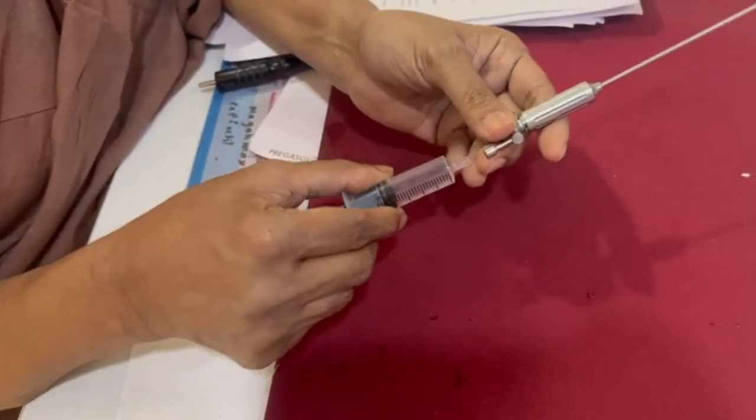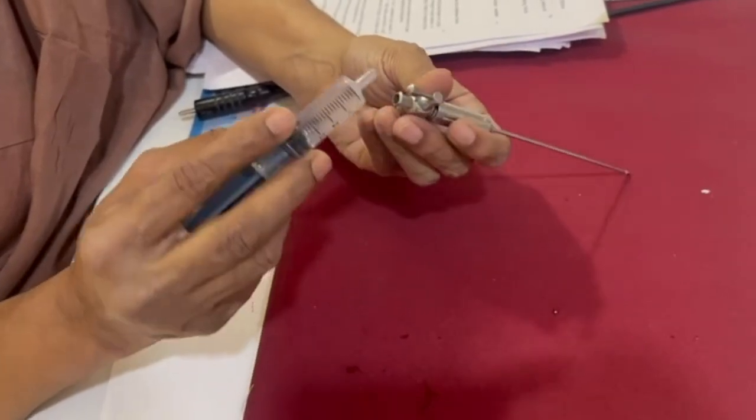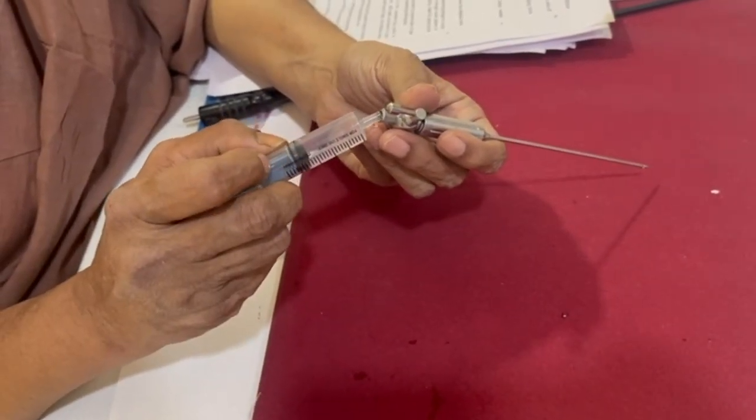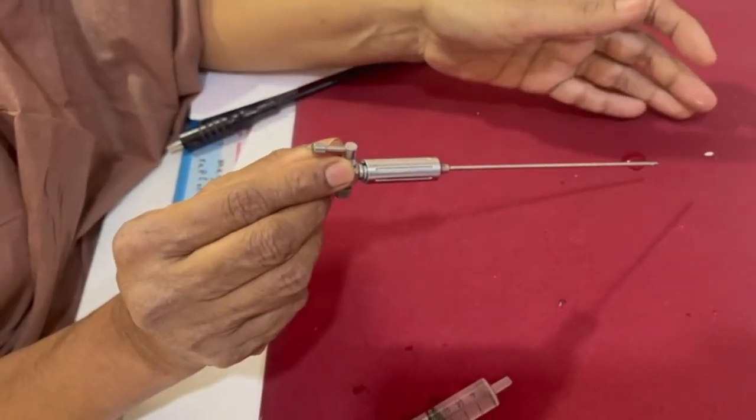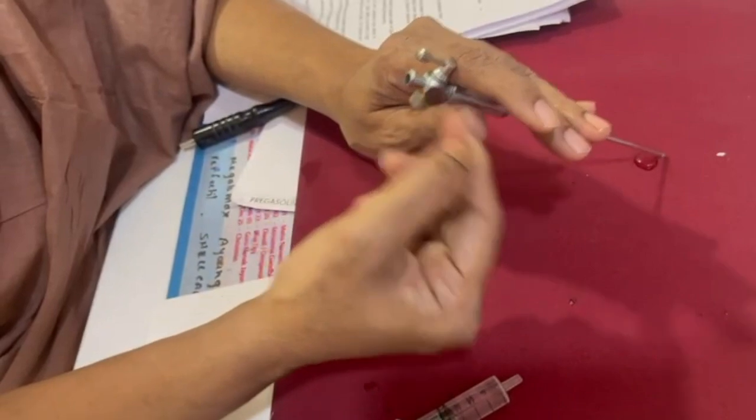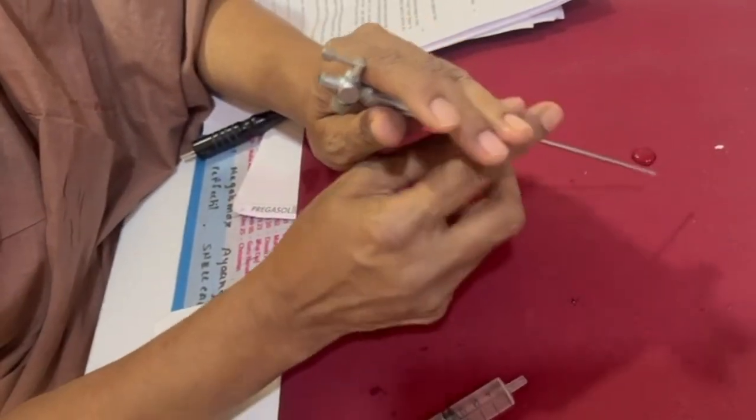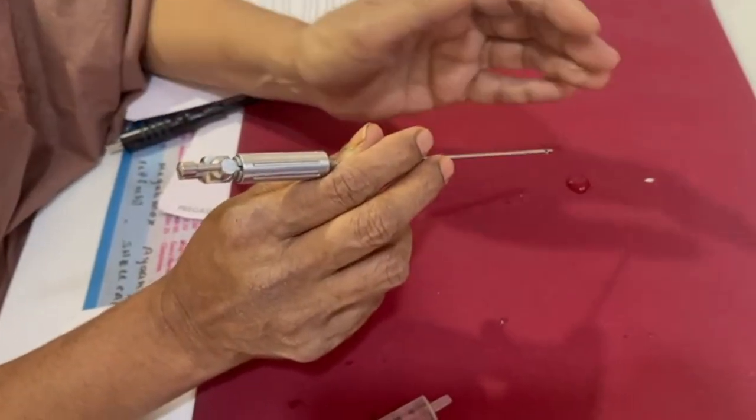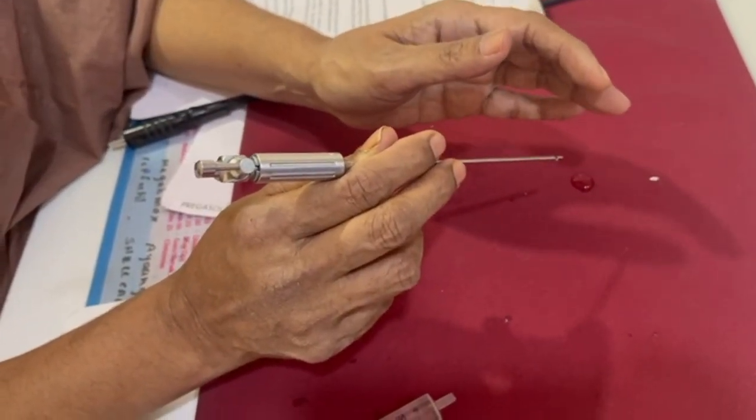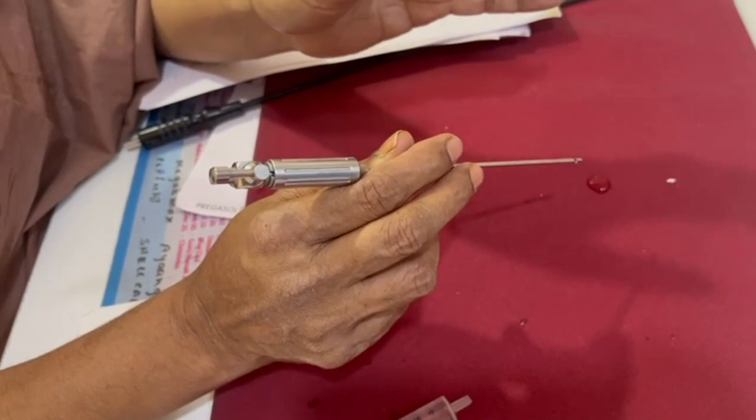The third test would be the hanging drop test. You just leave a drop of saline over the hub, and when you lift the abdominal wall, because of the negative pressure the drop gets sucked in. That is another test which tells us that we have placed the needle inside the peritoneal cavity.